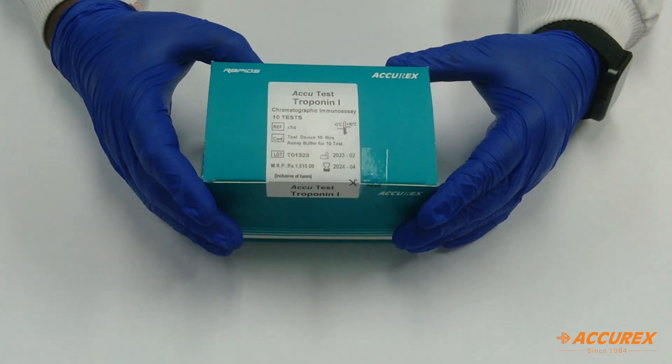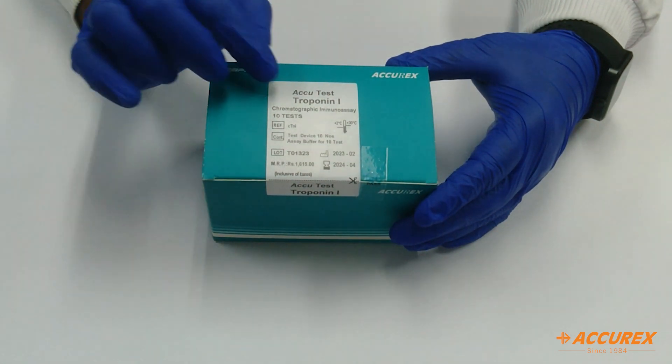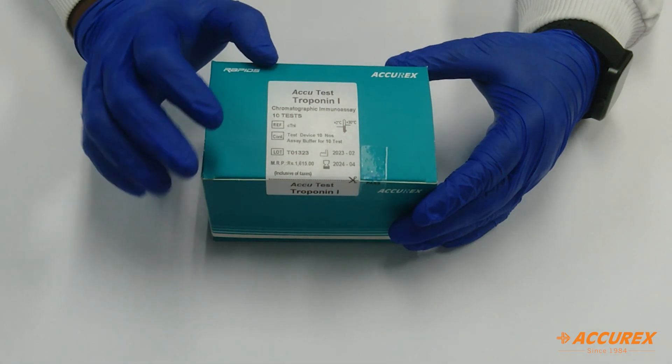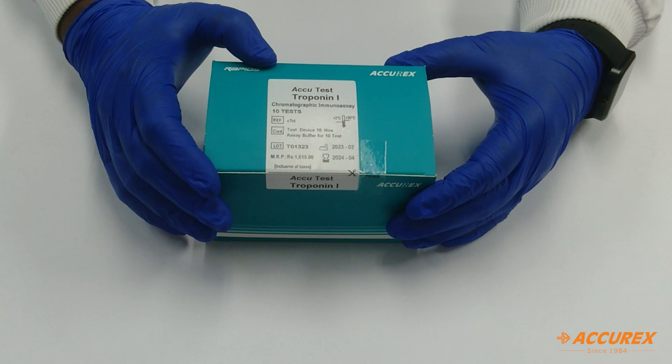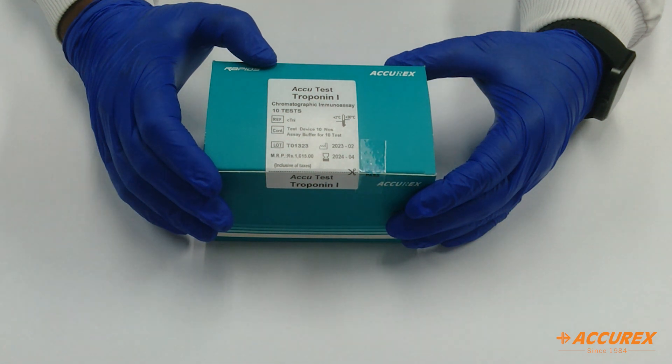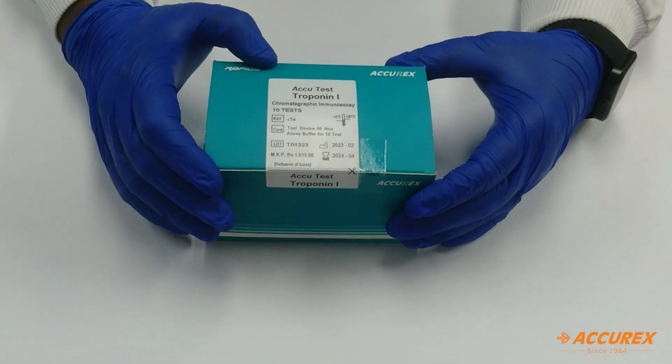Hello everyone, welcome to Accurex YouTube channel. Today we have brought a product called Accurex Troponin I. It is a rapid chromatography immunoassay method for the qualitative detection of human cardiac troponin I in whole blood, serum and plasma. It is an aid for diagnosis of myocardial infarction in the human body.